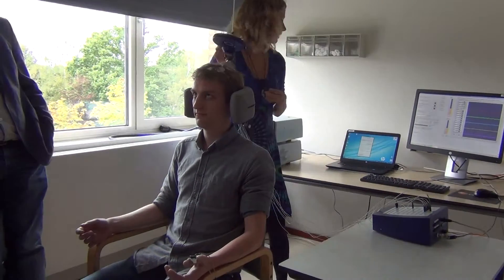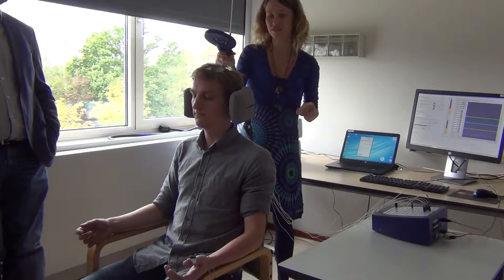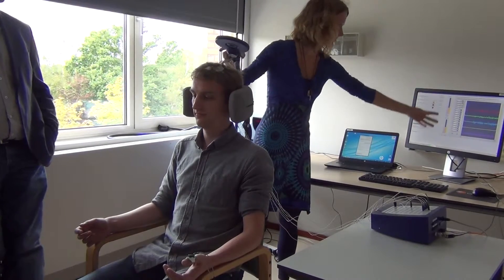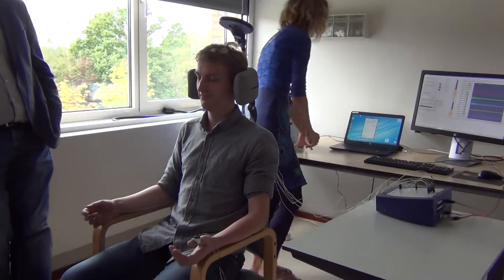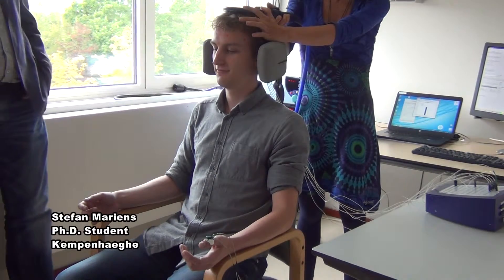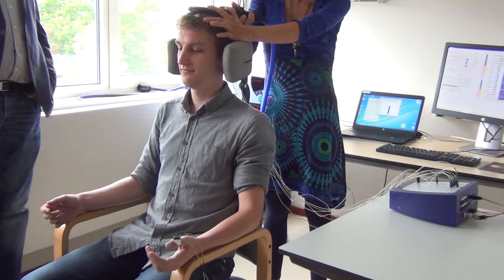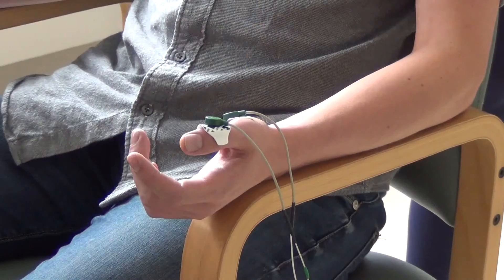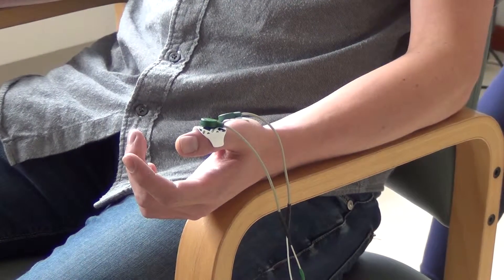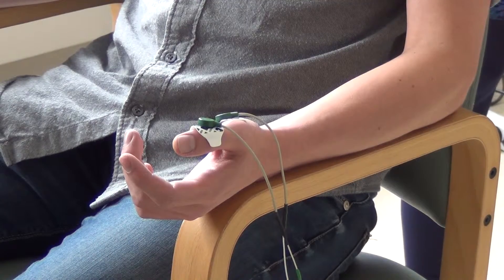I'll start with a reference measurement at 120% of the resting motor threshold I measured. You can observe what happens: you see a large stimulation artifact that starts, and after that you can observe a motor evoked potential — the movement of his thumb.